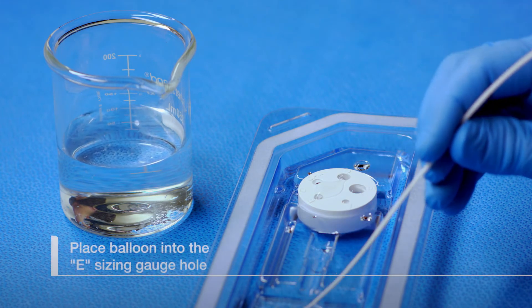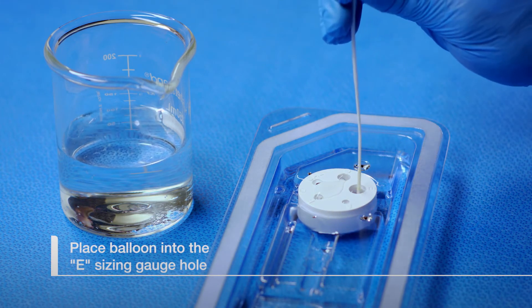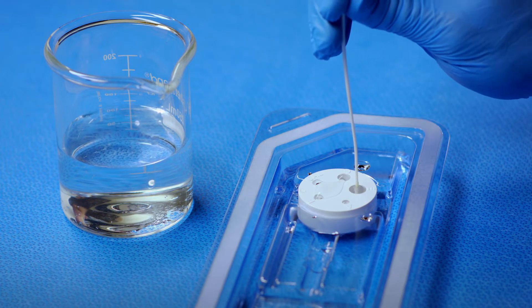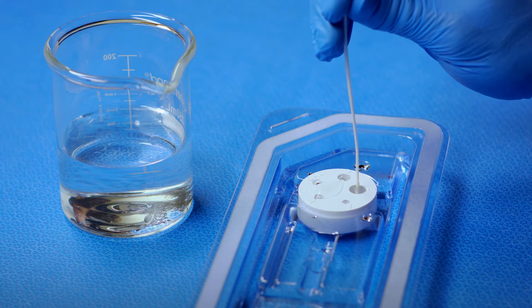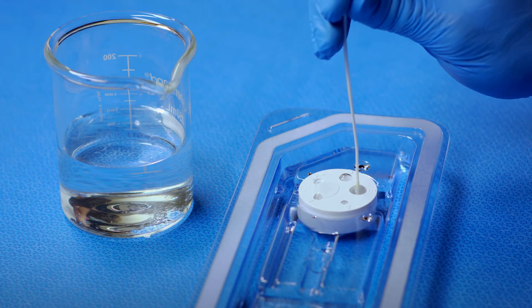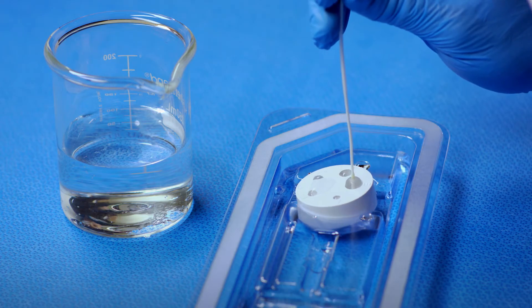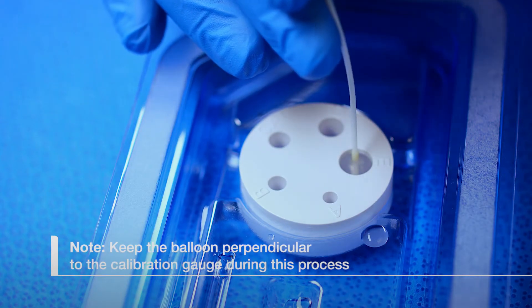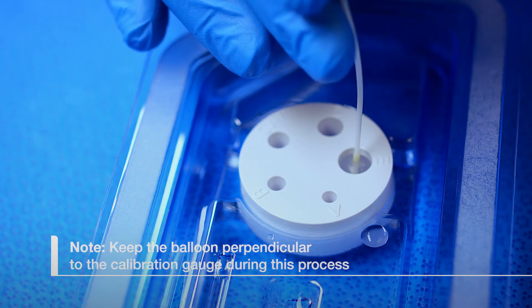Place the deflated balloon in the center of the E sizing gauge hole on the calibration gauge. Slowly inflate the balloon until it just touches all sides of the E gauge hole. The balloon should drag slightly when moved in and out of the gauge hole. Note, keep the balloon perpendicular to the calibration gauge during this process.